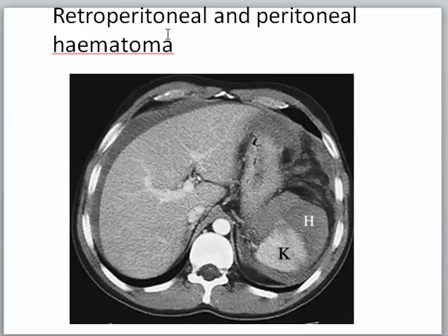The difference between retroperitoneal and peritoneal, of course, this is peritoneal, and here it is around the kidney. It is retroperitoneal, limited by the line. So long as it is limited by the line, it will be contained within Gerota fascia. If these areas are soiled, it is pararenal hematoma.